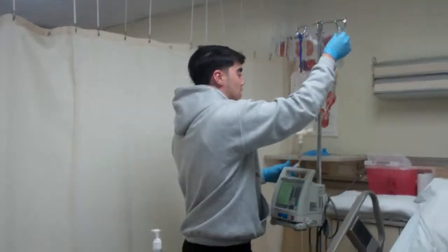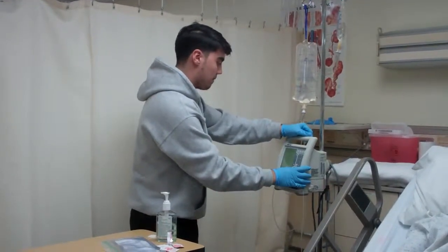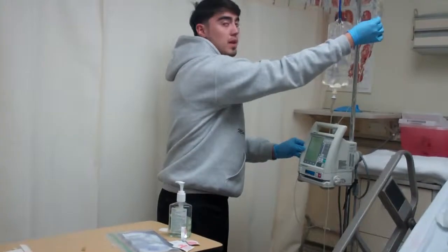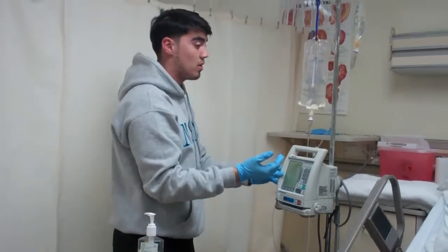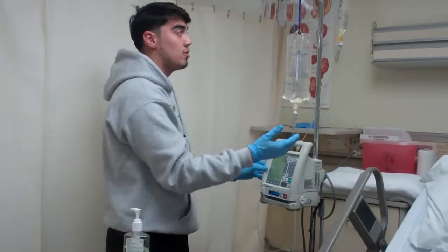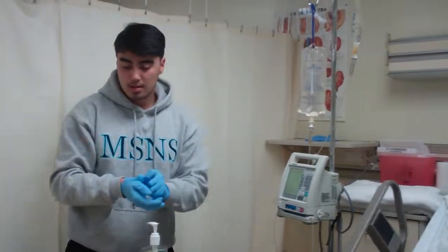Now that we've had that set up, what we're going to do is with our pump, go ahead and click our piggyback mode, and then in the rate, we're going to put the prescribed rate. In the volume, we're going to put the total volume of the medication plus the flush that's required so that the patient receives all of the medication. And then we're going to put the rate that also has the flush with it. And then now that we've done that, we'll go ahead and take this off.